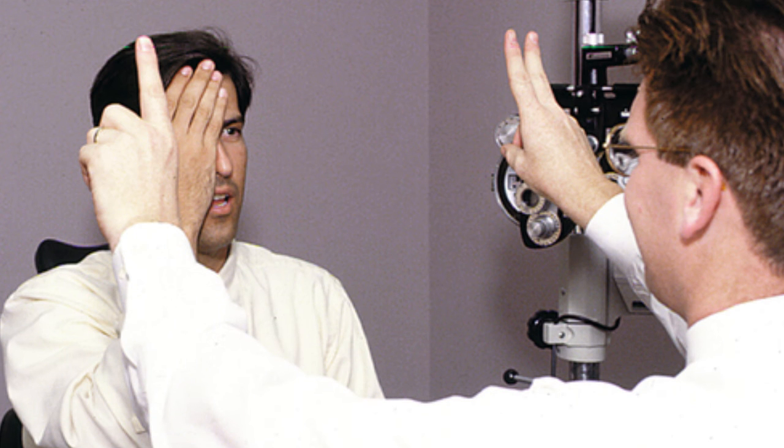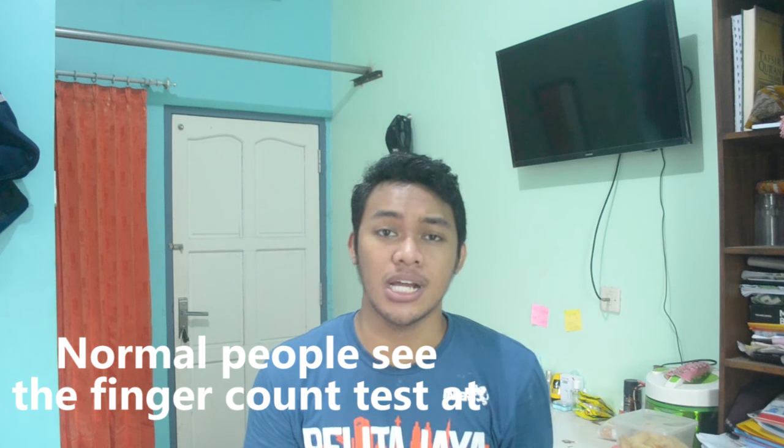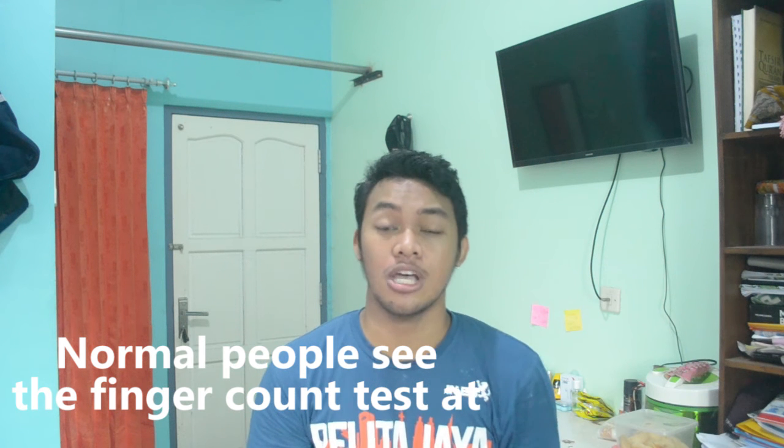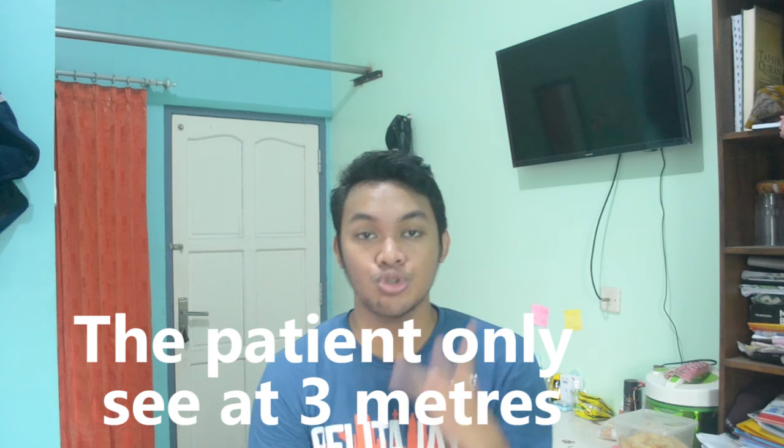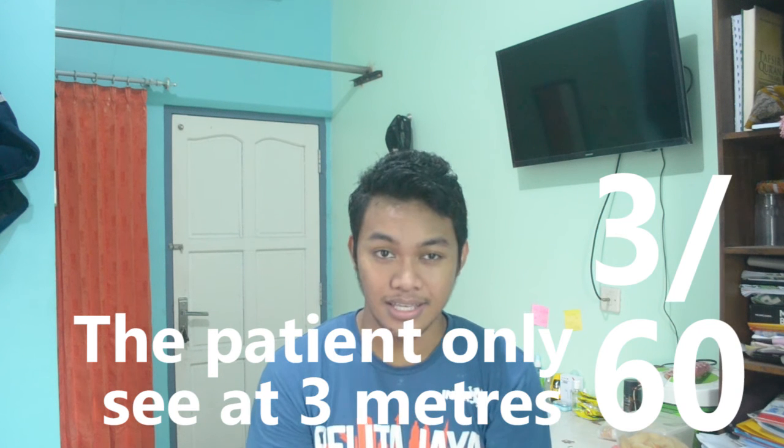If the patient cannot recognize the largest letters on the Snellen chart, then the finger count test is performed. The fingers can be seen separately by normal people at a distance of 60 meters. If the patient can only determine the number of fingers, for example, at 3 meters, then the patient's sharp vision is 3 per 60. With this test, the sharp vision can only be assessed up to 1 per 60, which means the patient can only count fingers at a distance of 1 meter.